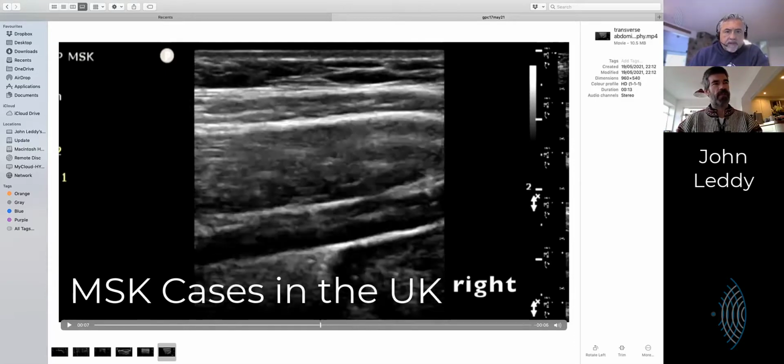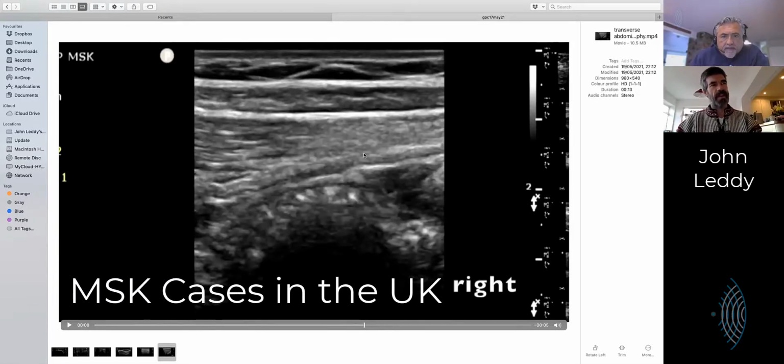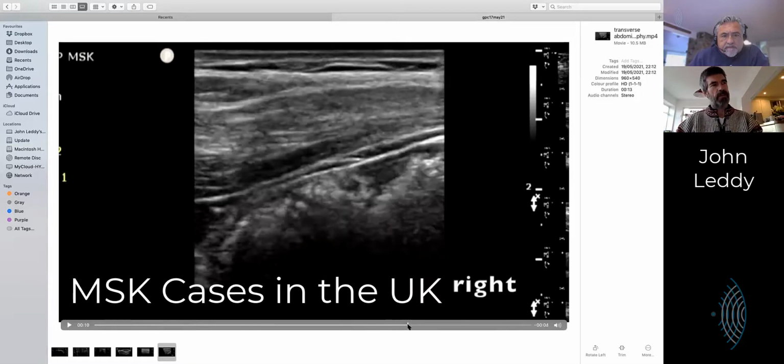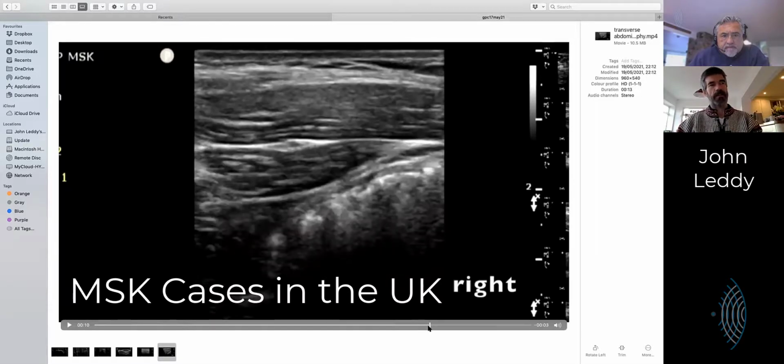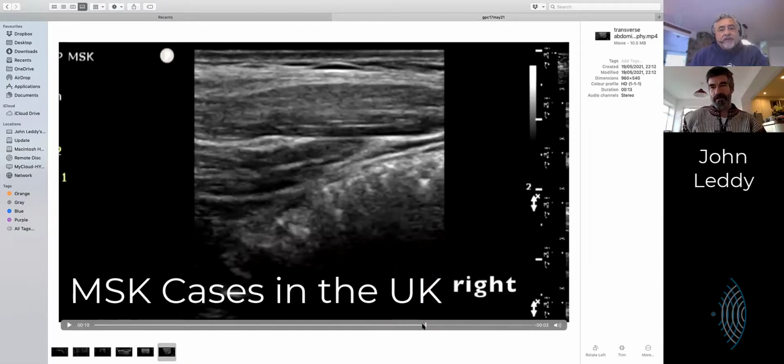So healthy muscle. Abnormal, it's got thin, and transversus has disappeared. And then you carry on down below the level of the crest, and you see it come back up again. So it seems like a component has retracted, like torn.